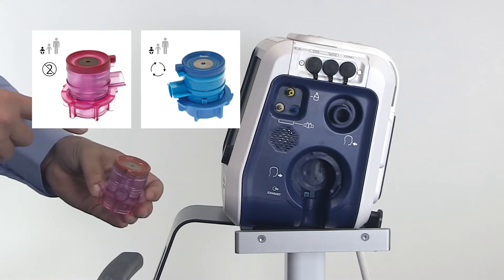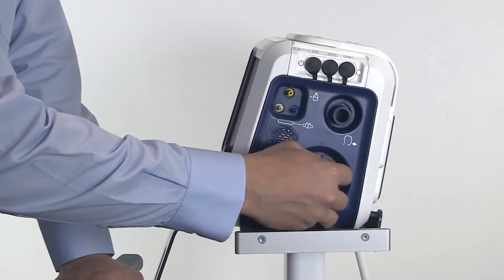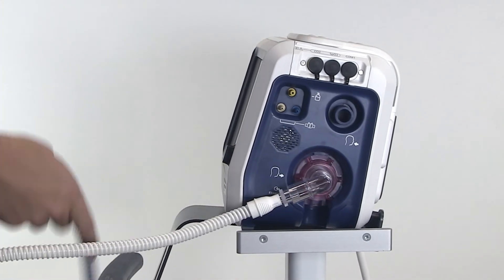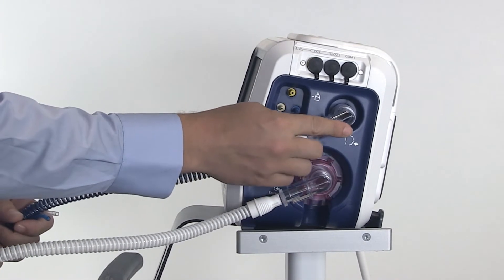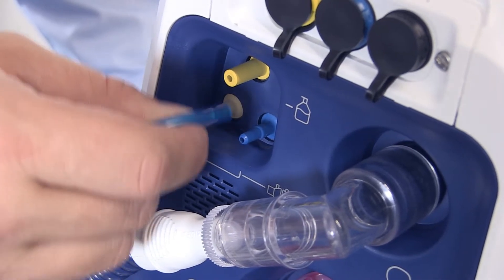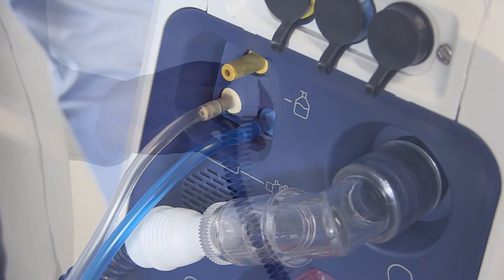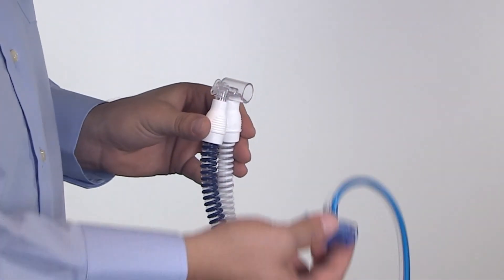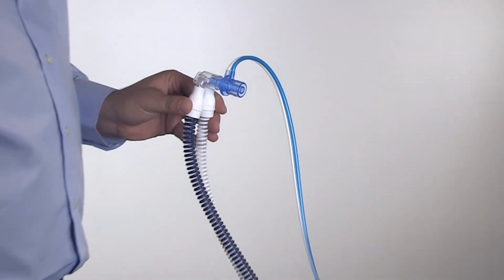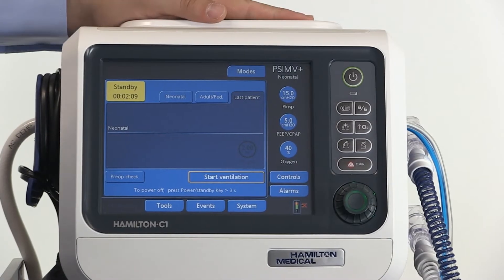Insert the neonatal expiratory valve. Connect the inspiratory and expiratory limb of the neonatal breathing circuit to the device. Connect the tubes of the neonatal flow sensor to the device, and connect the flow sensor with the Y piece. Now take the neonatal test lung and connect it to the flow sensor.